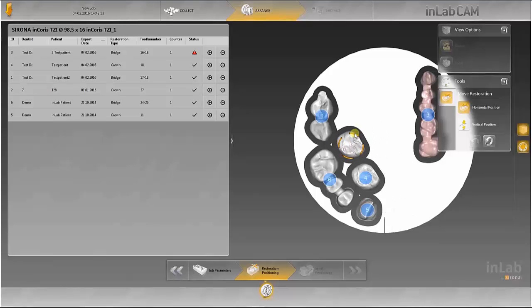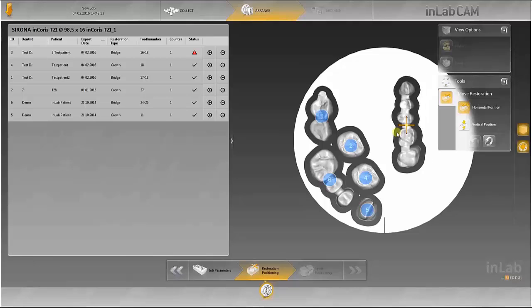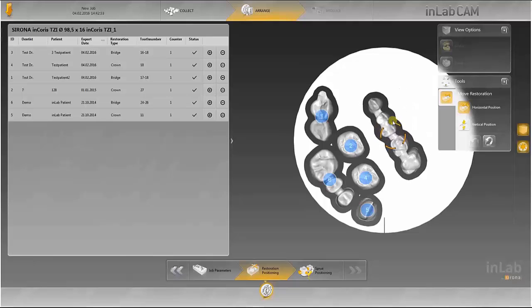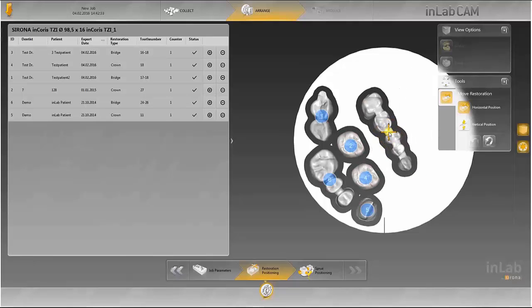All the designs imported into the blank can now be positioned according to your requirements if you are not satisfied with the positioning suggestion from the InLab CAM software.